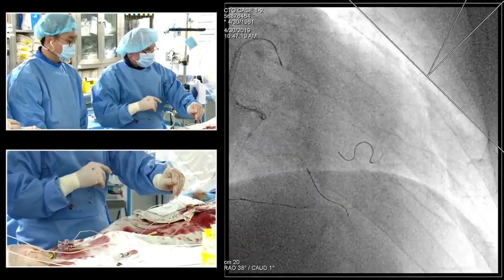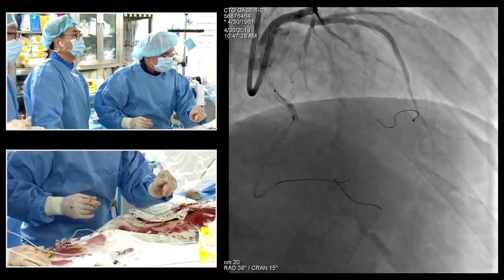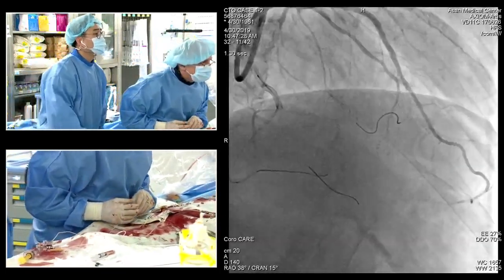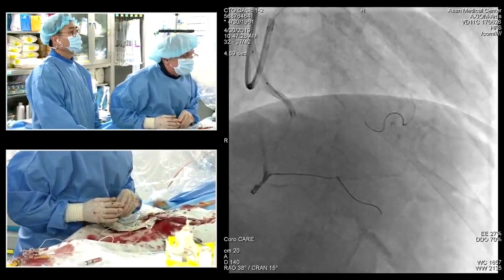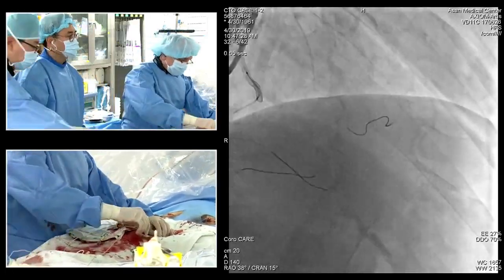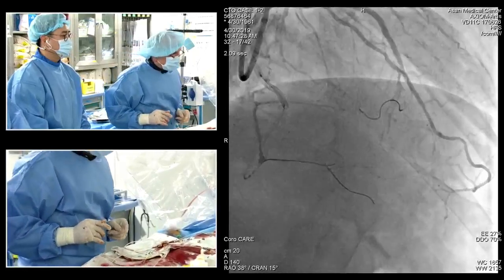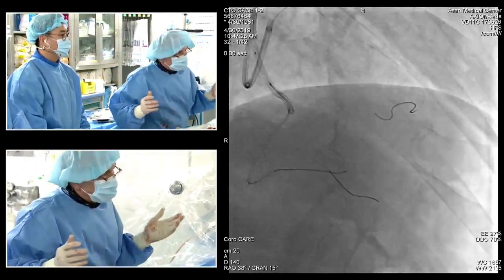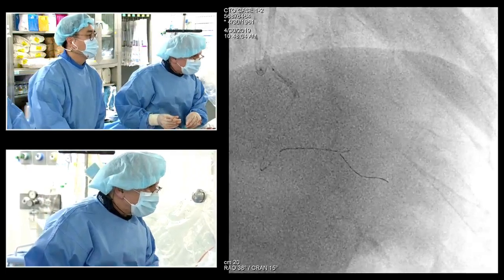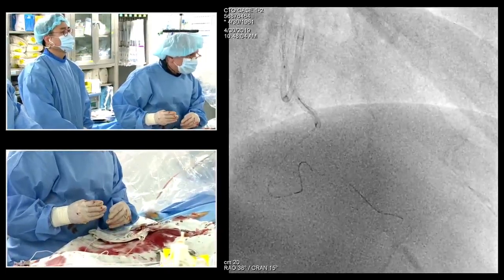Okay. Cranial. Cranial. Okay. So do an injection, and then I remove this. Fluoro. Stop. Okay, that looks okay. Yeah, you see the tiny, tiny channel that we had there. So I removed this. Patient was always a little bit symptomatic. Now we remove the... It's not the ideal wire position. I don't know why I don't get up there. Let's try it in this projection. There seem to be more branches than.